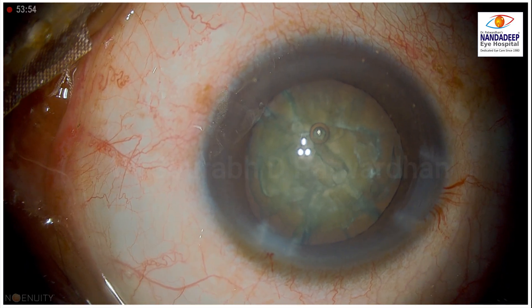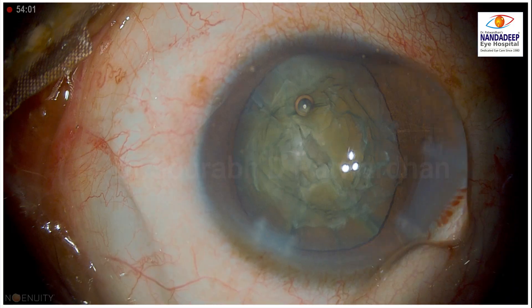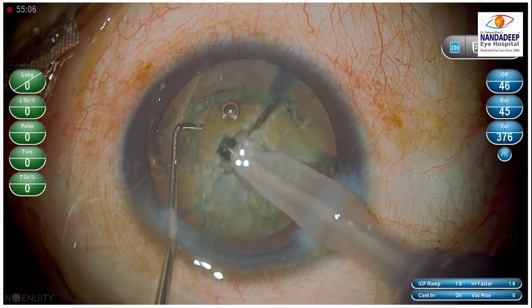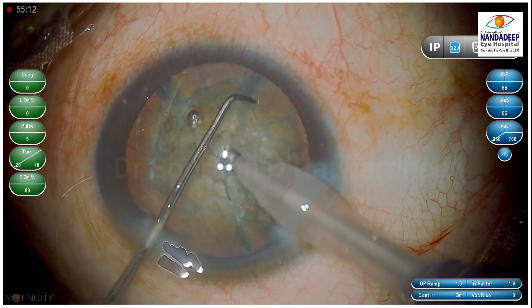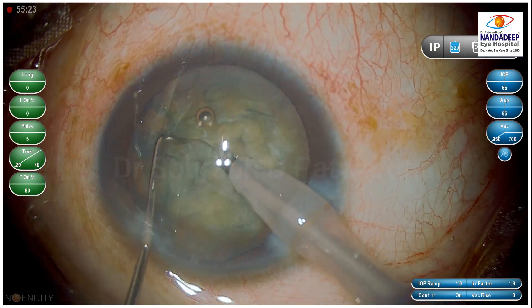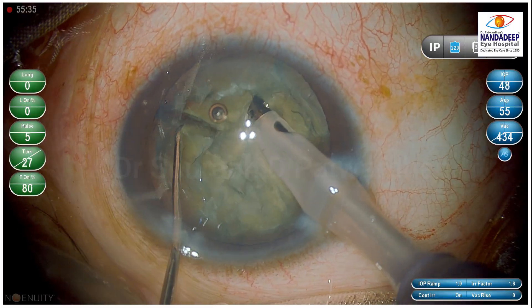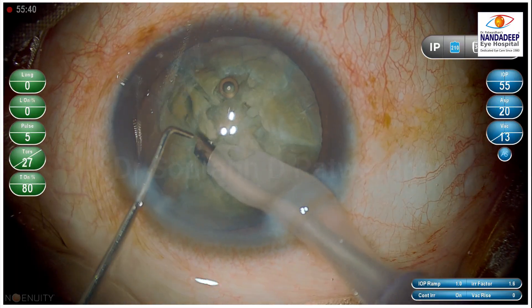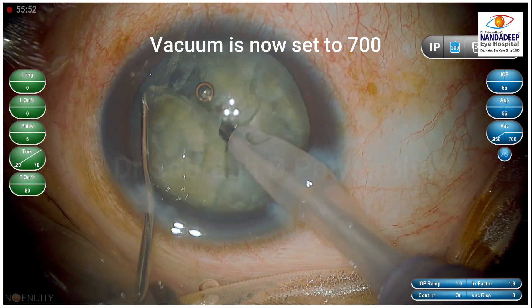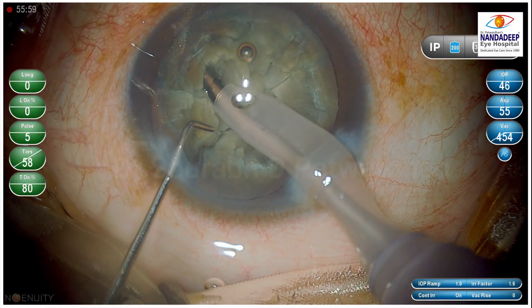I have asked my assistant to check the fittings, check whether the aspiration tube is properly fit, and also prime the cassette of the machine. After priming the cassette and going ahead again, I realized the phaco tip is still not able to hold the piece properly. I am separating pieces mechanically more than because of hold over the nucleus. When I try to pull out one quadrant, the vacuum is not picking up — I have set it at 700 and it still cannot pull out the well-separated quadrant. There is something definitely wrong.